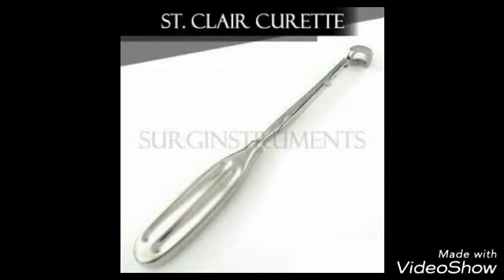It is the St. Clair Thompson adenoid curette, used in adenectomy.